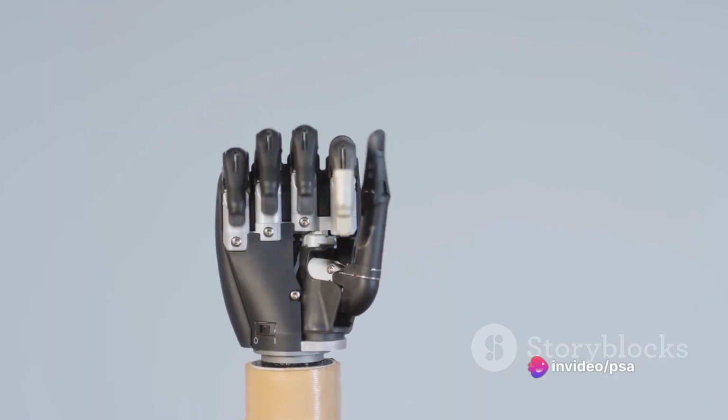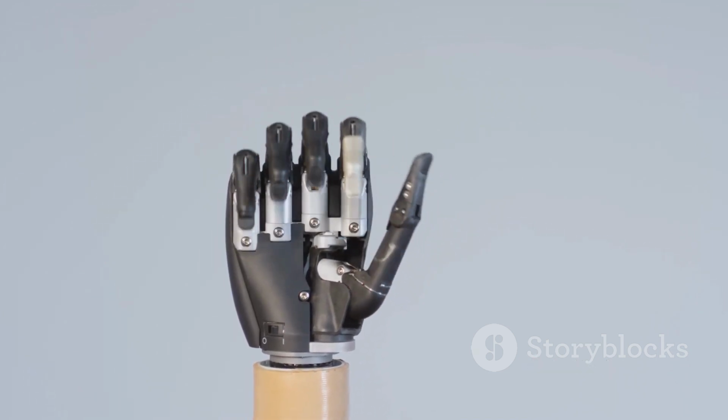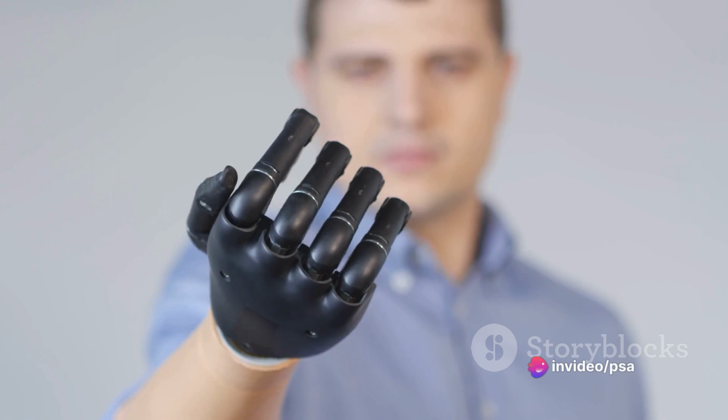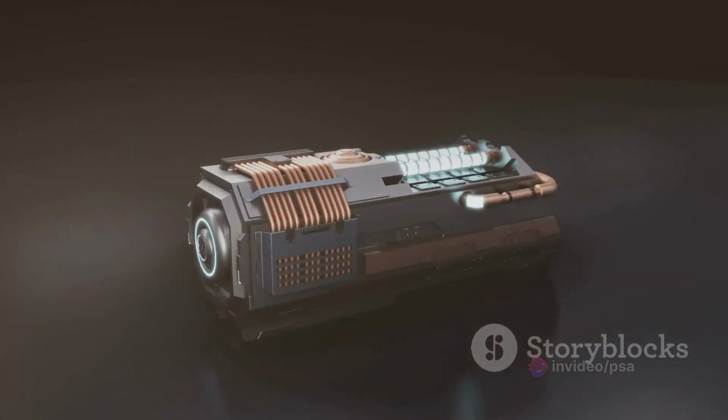This electronic skin is not just a piece of equipment, it's a leap towards normalcy for those who have lost a part of themselves. It's a thin, elastic material that can adapt to irregular surfaces, like a human finger, and it can convert pressure and temperature sensor signals directly into brain signals. The device uses a circuit to transform these sensor signals into pulse waves, commands that the brain can understand. So when this skin is touched, it sends a signal to the brain, just like our natural skin would. This isn't just mimicry of human skin, it's an emulation, a tribute to the complexity of our bodies.